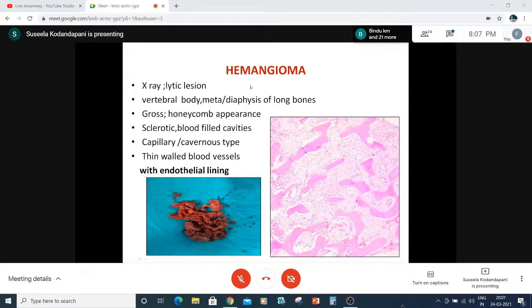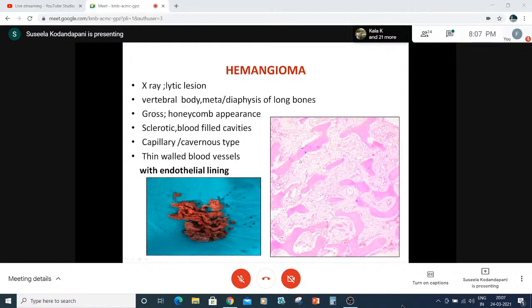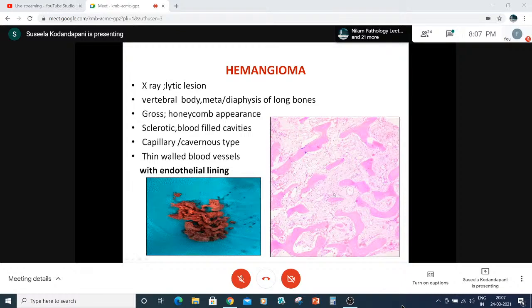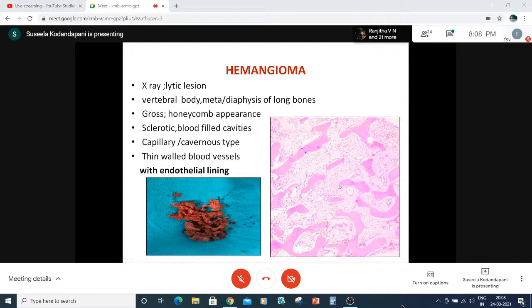Vascular lesions: hemangioma. We recently received a case where radiology called it ABC. Curettage and cementing was done — it was involving the vertebral body. We saw blood-filled cavities with cavernous and capillary type hemangioma. One key point: these vascular spaces all have endothelial lining, which is the differential point with ABC. So it is not a case of ABC but a hemangioma in the vertebral body — radiology had misled us.